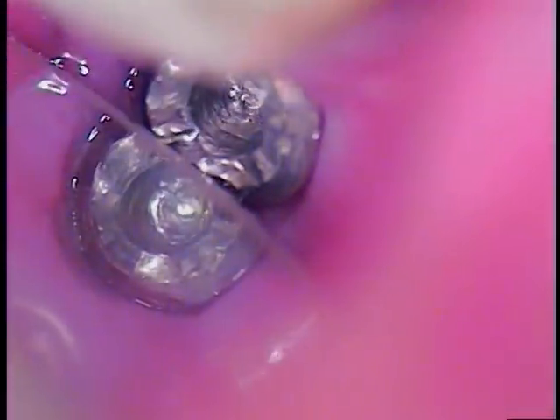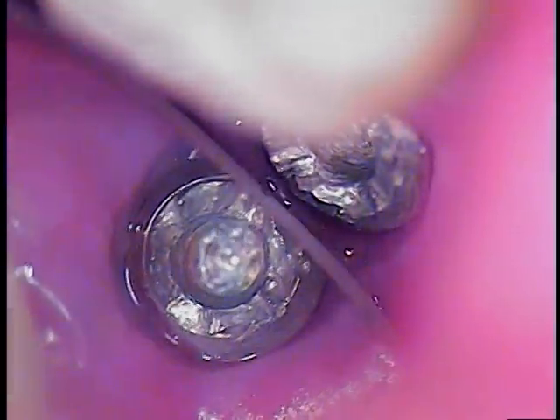Air on the mirror. Can you raise your chin up a little bit? I think what I'm going to do is bring you back a little bit, and I'll go off the angle of the mirror a little bit more so I have more room to look through. I'm trying to divide the load here on what angle's best, so this is all better for us.